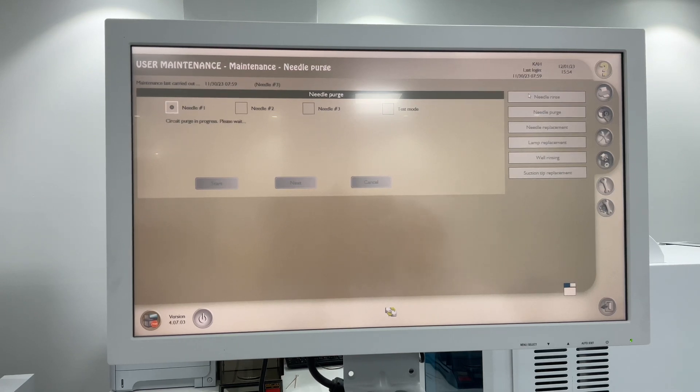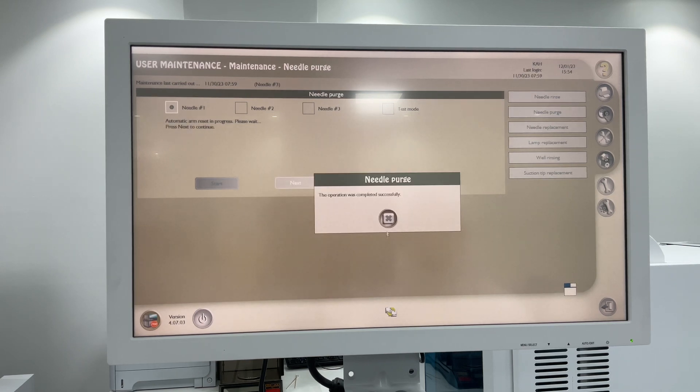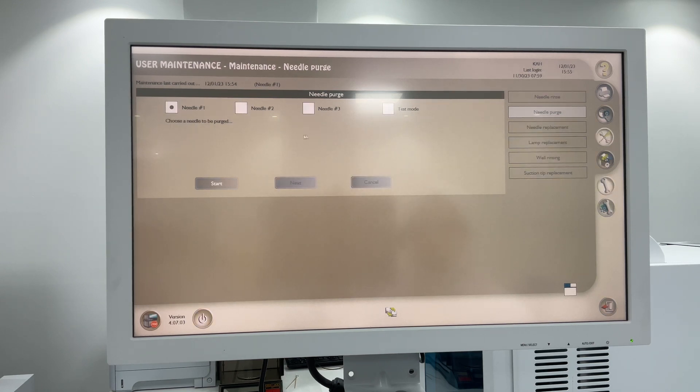Now it's purging. Click on needle two and Next. Next, then Next again, then Complete. First needle done, then click on the second needle, Start. Start, and the same with the third needle - Start and complete the process.